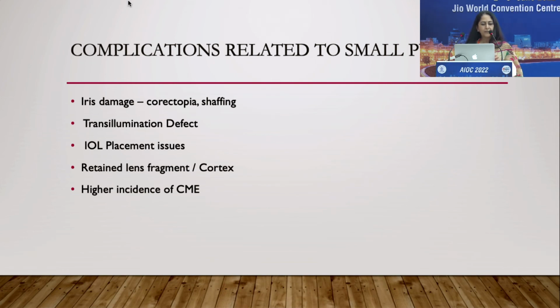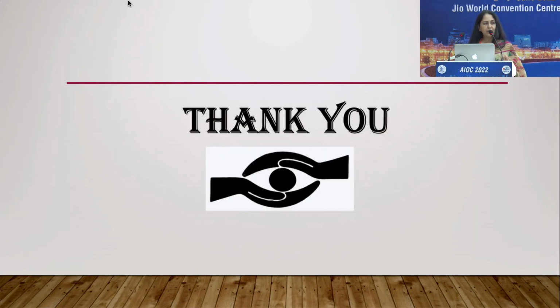And IOL placement issues also could be there. One of the haptics could not have been put inside the bag because the pupil was small and you were not able to gauge where exactly you were supposed to leave your haptics. There could be retained lens fragments or cortex. One thing I would like to say is always hydrate the ports before leaving. Sometimes one of the nucleus fragments is hiding in the side port, or in a small pupil it could be under the iris, which may later cause a CME or a glaucoma or other problems. And in any case where you've done a lot of maneuvering with the iris, there are chances of CME. So if the patient is not having good vision post-op, do an OCT to check and treat the patient accordingly. Thank you very much.